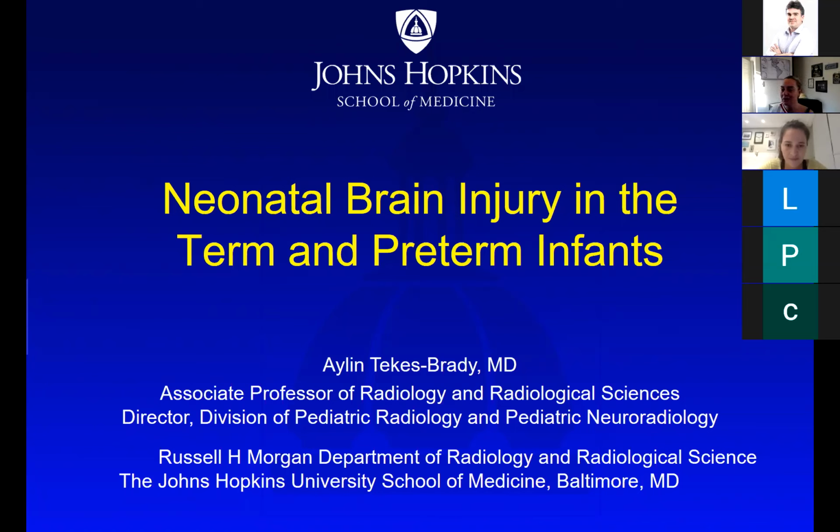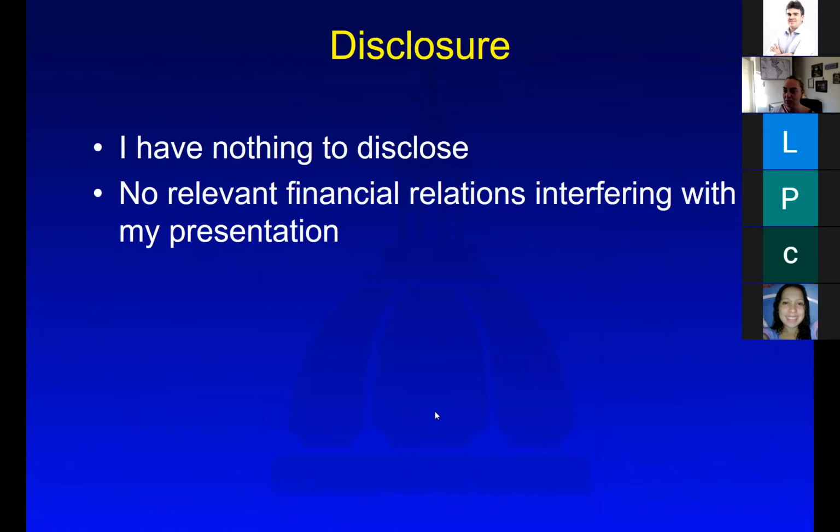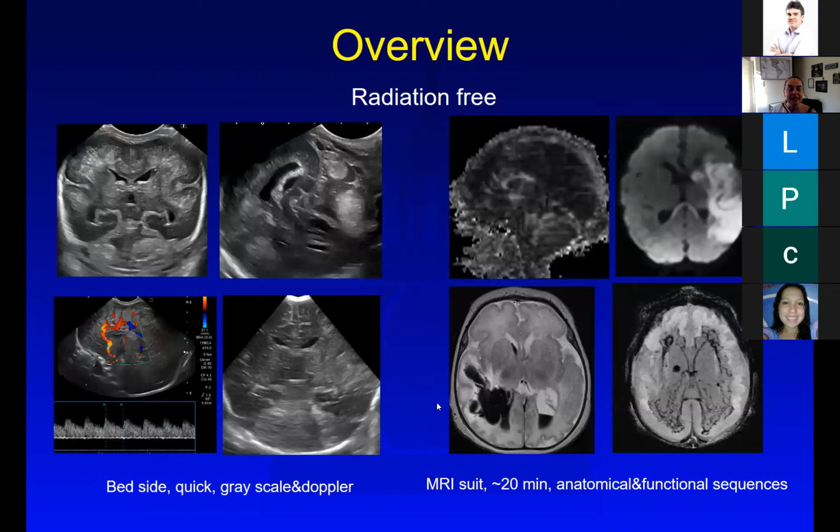In the next half an hour, I will talk about neonatal brain injury. This is a topic that I personally care a lot about. Babies' imaging are not as frequently performed compared to older children or adults, and there are a lot of pathologies that can be identified early on in life. There are some tips and tricks on how to better perform neonatal brain imaging, and I will try to share our experience here and show some cases. I have no disclosures.